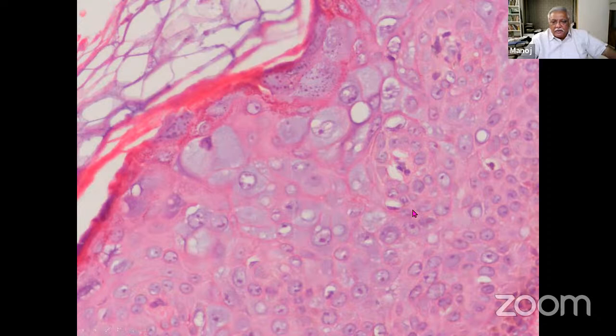Of course, this is an extreme example. And these are blue, these are not pink. So where did the keratin go? Once again, a great indication towards a particular type of condition. This blue stuff is virus. It's human papillomavirus. And in between, you have cells which are relatively more normal looking. And depending, you may have some cases where you have only 1 or 2 cells to look at.